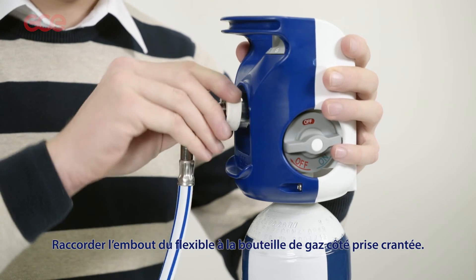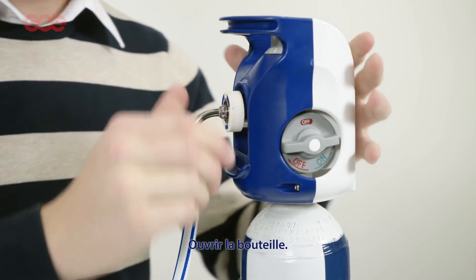Connect the probe to the source of gas. Open the bottle.